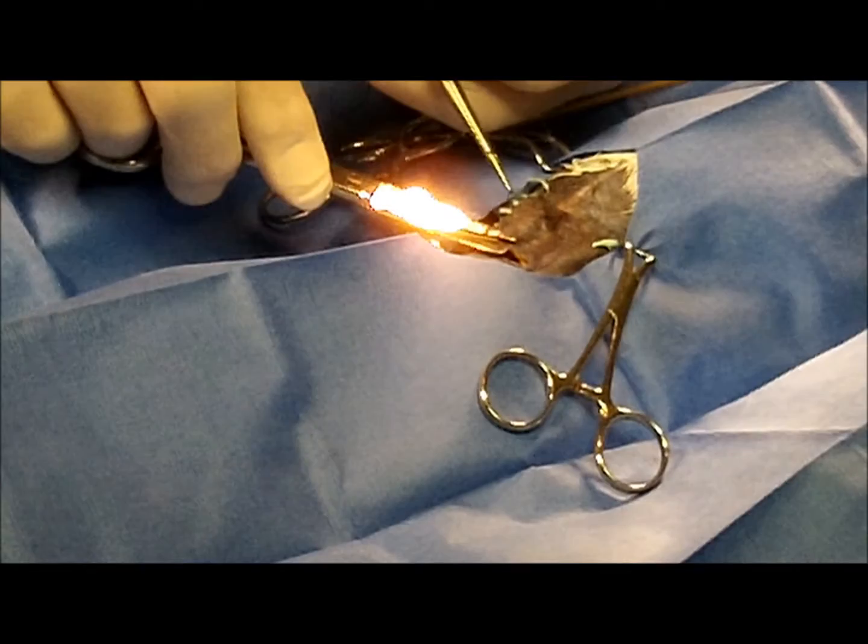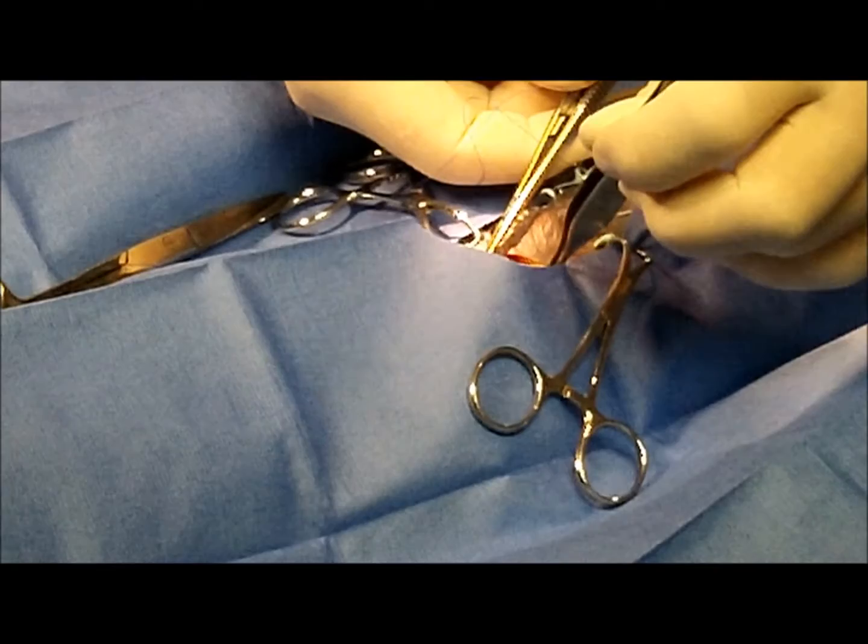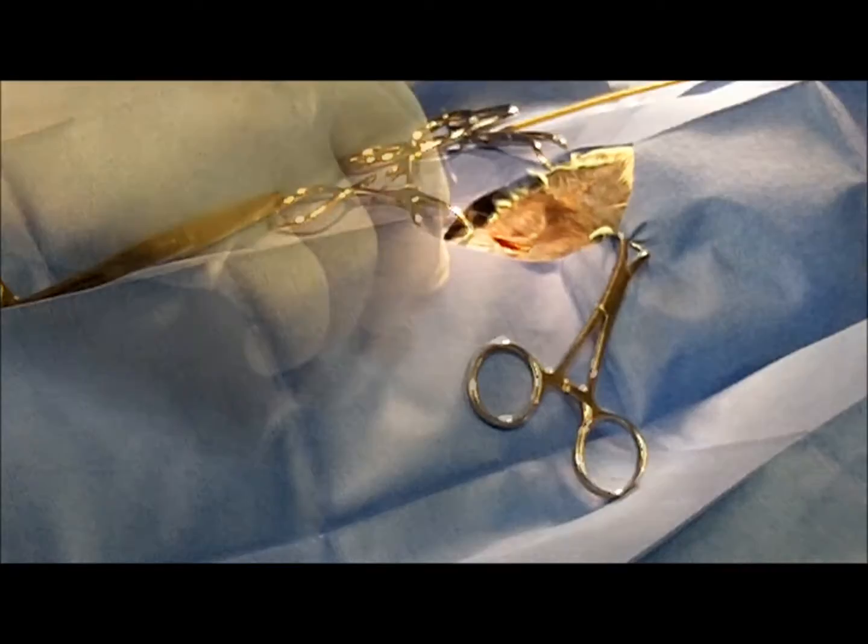Going to the other side, cutting that off, and we're anchoring to the other rib. Making a nice tie there.